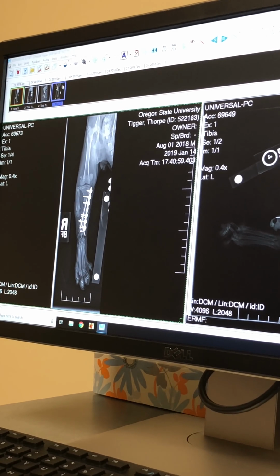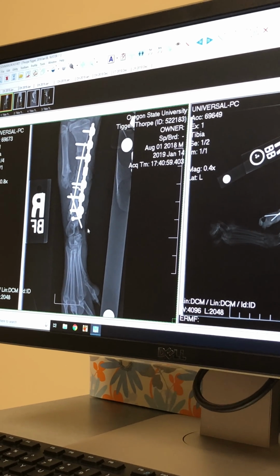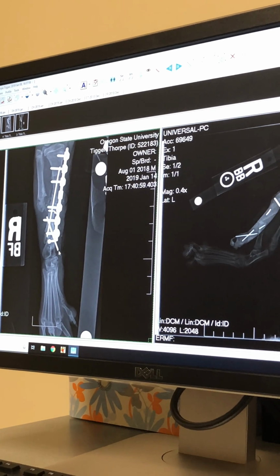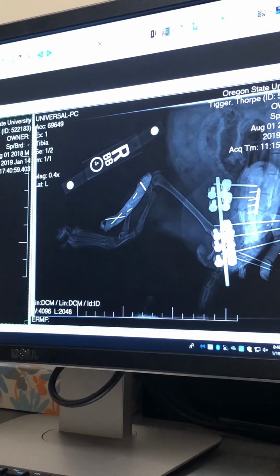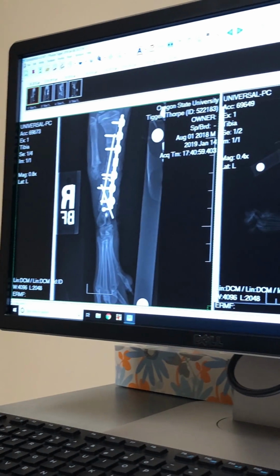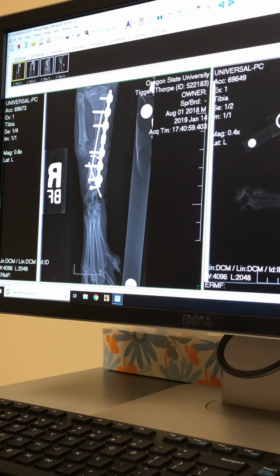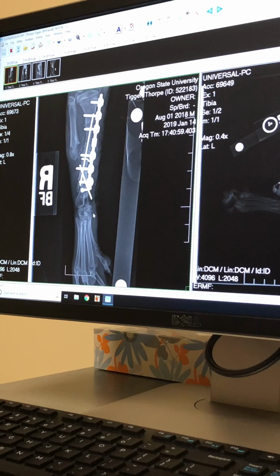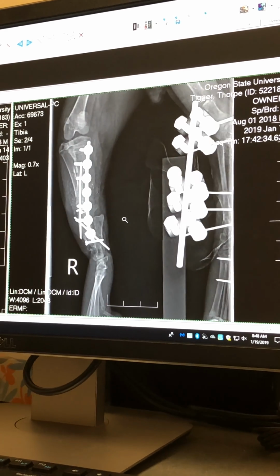And in addition to that, the other thing that we found was that his ankle had kind of broken down, because it was never a normal ankle to begin with. And initially when he first had surgery, the ankle was really firm, but as he was walking with his external fixer for the first time in his life, actually bearing weight on that foot, the ankle collapsed. So then we had to go through, and you see there's a really tiny little screw going through this way, and a little pin coming through this way. So that's his ankle joint from here to here, basically. The bones are totally abnormal because of his congenital deformity, but his ankle is a lot more stable here too.